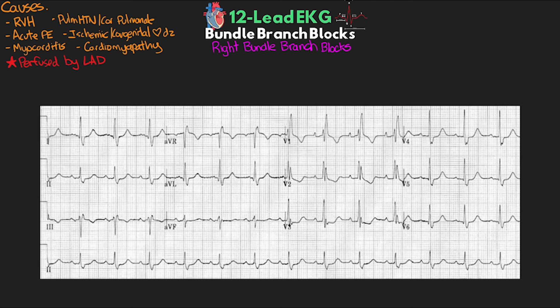Here's a second example. Looking at V1, it's clear the QRS is greater than 0.12 seconds or three small boxes. Evaluating V1 further, we again have that classic rabbit ears or M shape with the terminal wave deflected up or positive, along with a discordant negative T wave deflection. Using our turn signal method, we know we're turning right — thus right bundle branch block. Our terminal wave in V6, as well as leads 1 and AVL, are deflected negatively, opposite of what we have in V1.